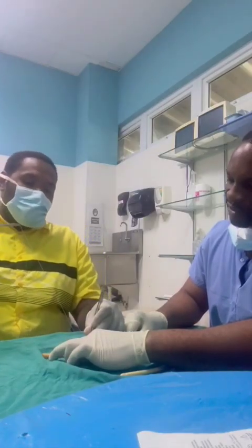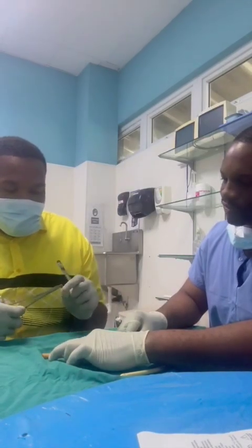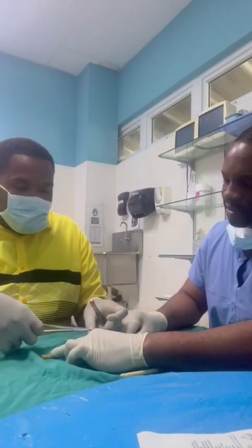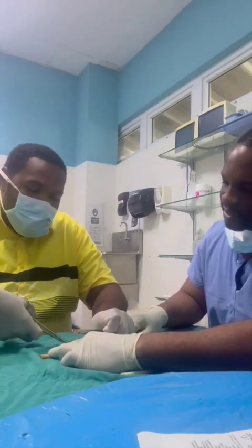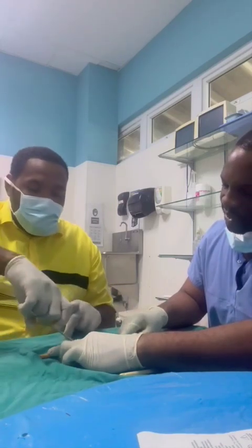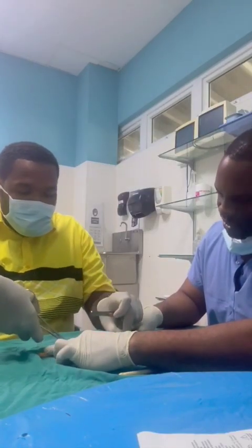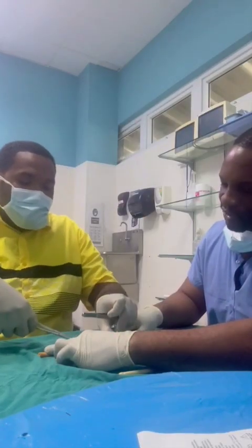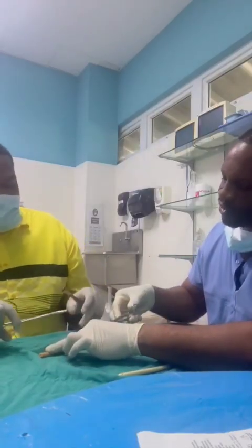Roll it through. Very good. Let's give that a quick knot for us. That's a surgeon's knot. Excellent. Always remember to take the knot off the wound. Very good, Dr. R. So unlike the Prolene, for this Vicryl that you're using, you can use 3 throws, which is very good.